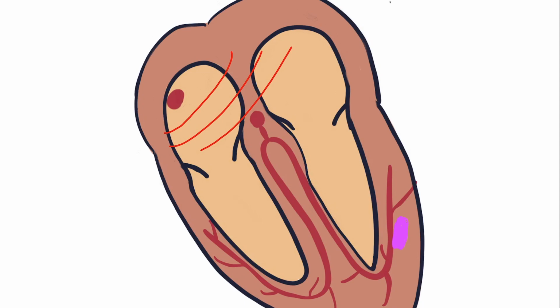Therefore, everything is slower, and it starts on one side and has to go all the way across to the other side of the heart. The duration of the QRS complex is telling us the duration it takes for depolarization to occur. And so because it's inefficient and it's also traveling from one side or the other, instead of usually in the intraventricular septum, we end up with a wide QRS complex.